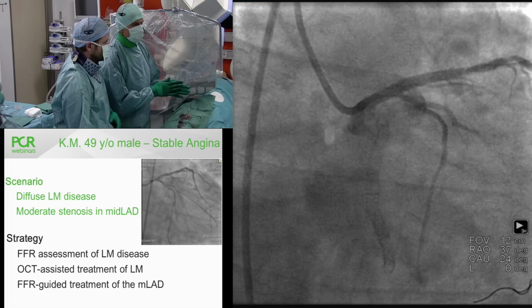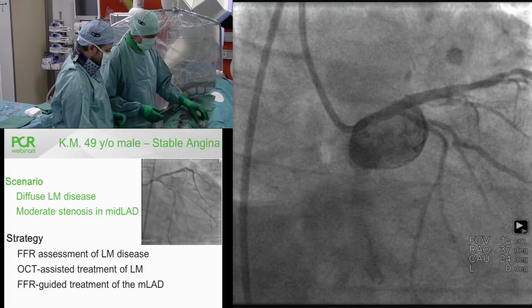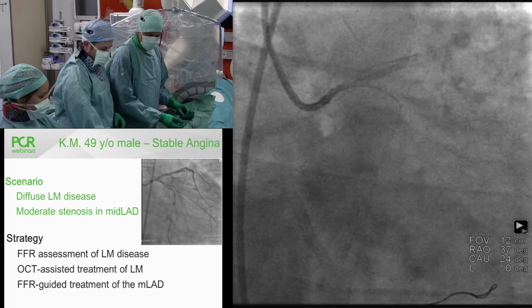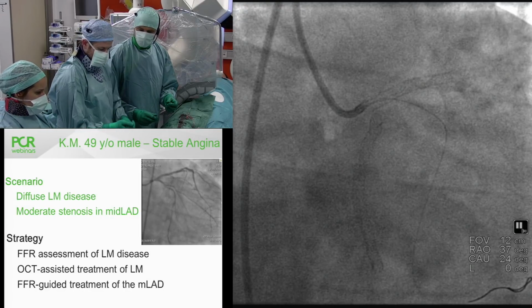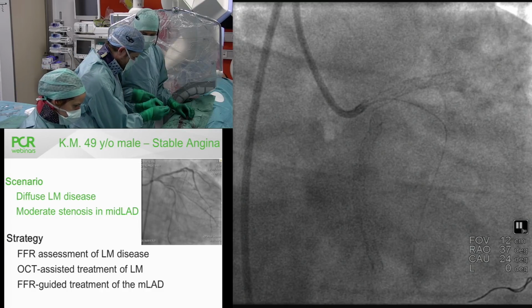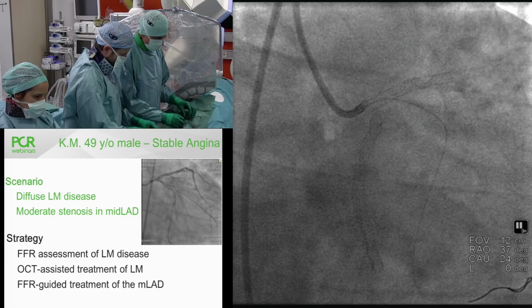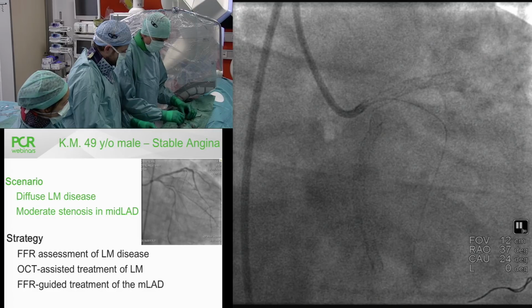Okay, so we are going to post-dilate now the left main with the so-called POT. We have a 4 mm balloon, and I will take a semi-compliant 4 mm. There is no calcium, so the goal is to reach actually probably 5 mm here, progressively. And we only have 8 in length. We do not have 12 or 15 anymore, which would have been more convenient, but that's not a problem at all. We will fix this.